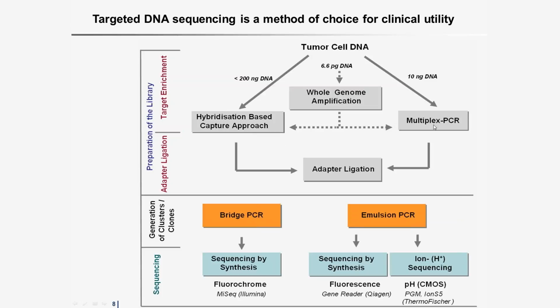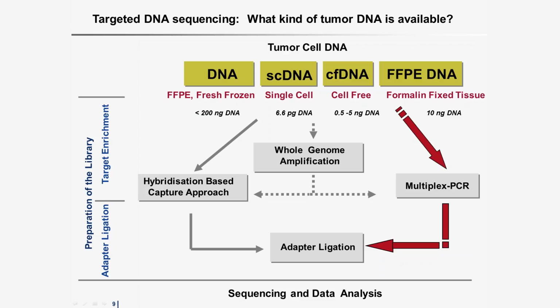And in this approach, by multiplex PCR, we enrich the targets by PCR. So in general, hybridization-based capture methods need more DNA than the multiplex PCR approaches.